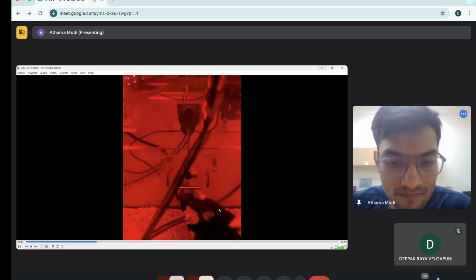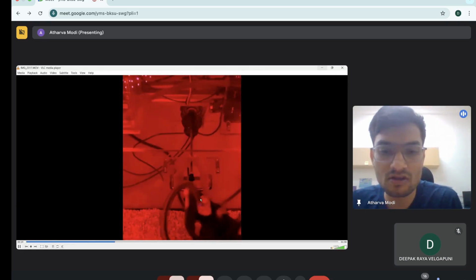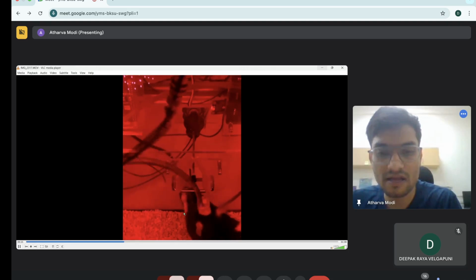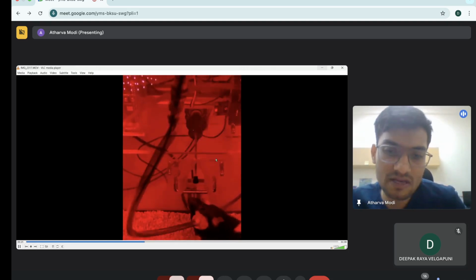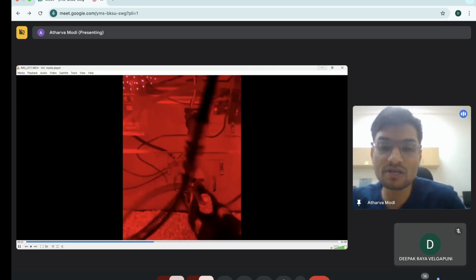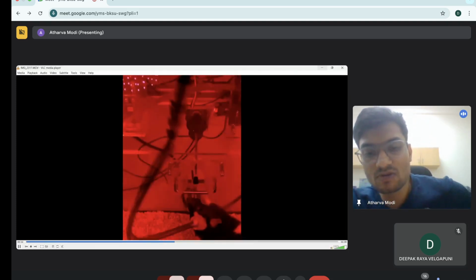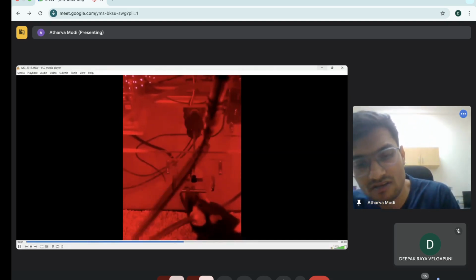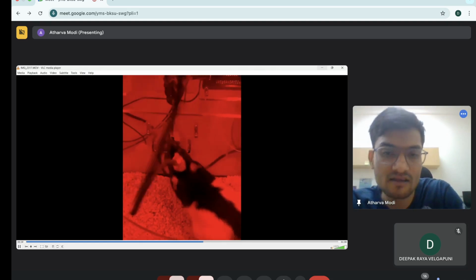So basically, this is an optical fiber on top of the head, inside the brain of the animal, and it's doing some task, and we are continuously measuring the activity. You can see that bluish or UV tint on the optical fiber at the brain.